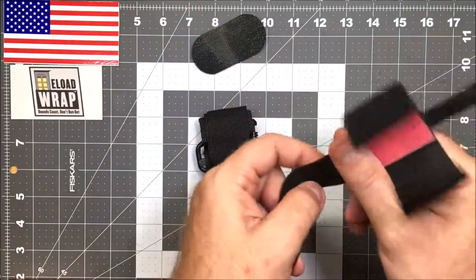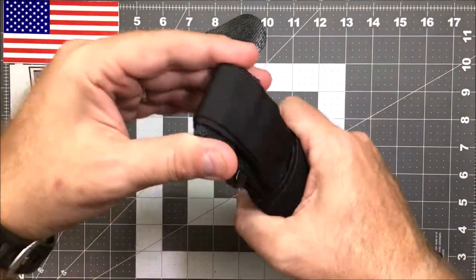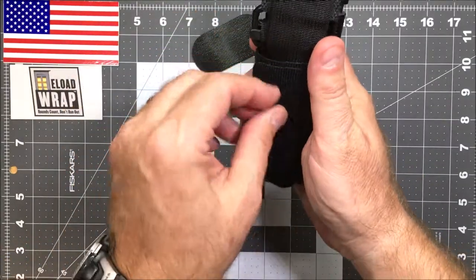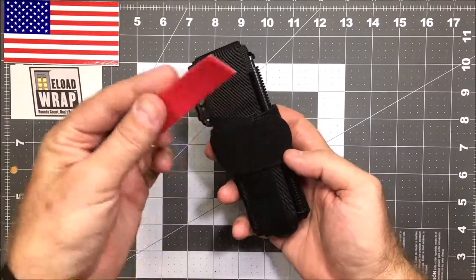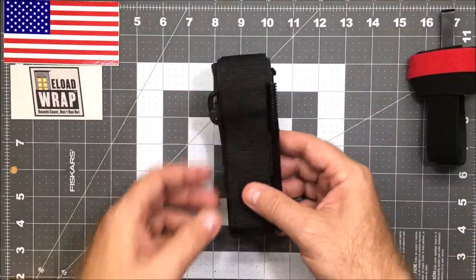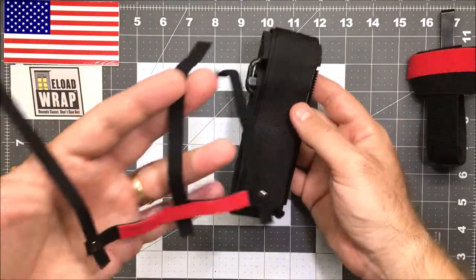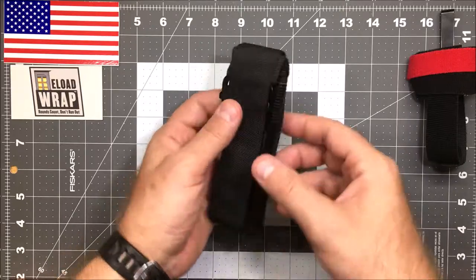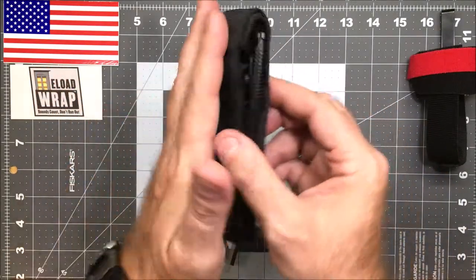We can refit the holster — the thinner the profile the more it lends itself to being carried. You've got some reinforcement caps, and the revolver strap you could put along the top to help add a first-aid component, and then quickly access this tourniquet if needed. We're working on a separate rig to make tourniquet use quicker. But right now if I was EDC-ing anything it would be the SOF-T W Tac Med Solutions Gen 4 — it's roughly the same price, about $28-29, same as the CAT at $27-29 — and this is the one I'd do simply because it's thin.